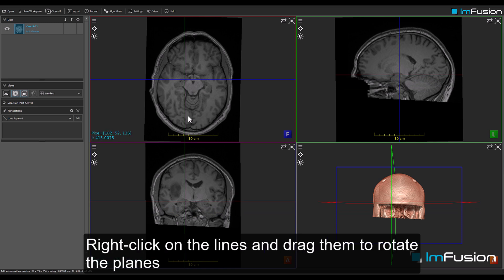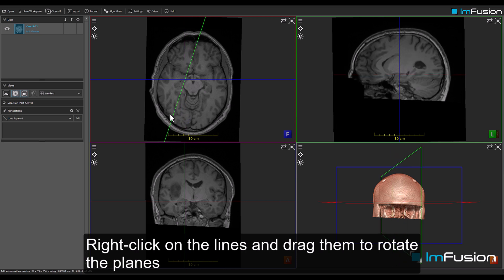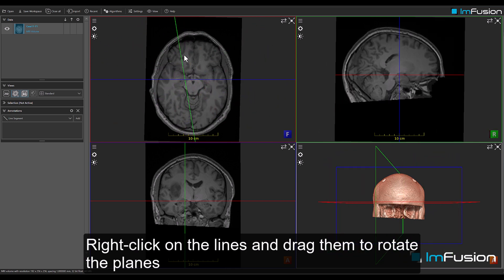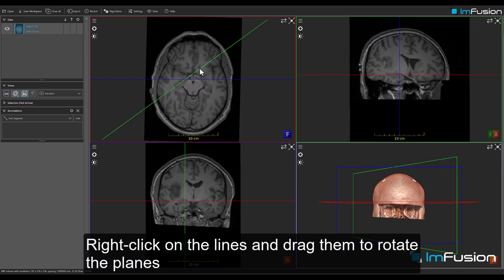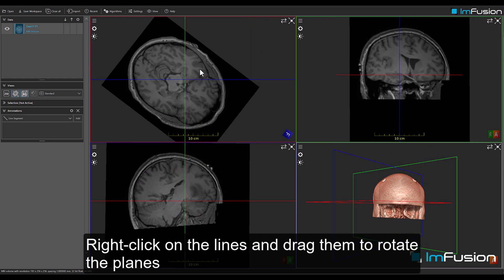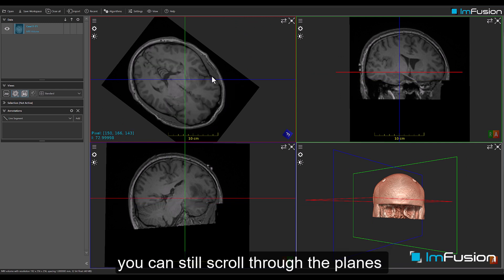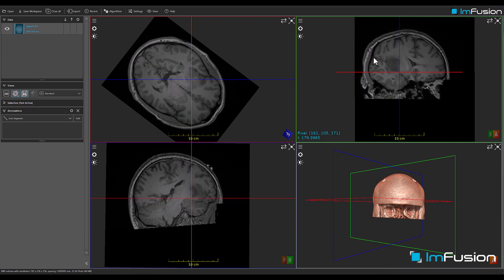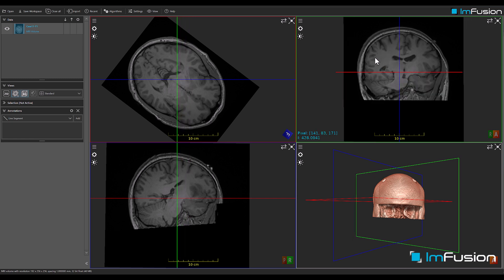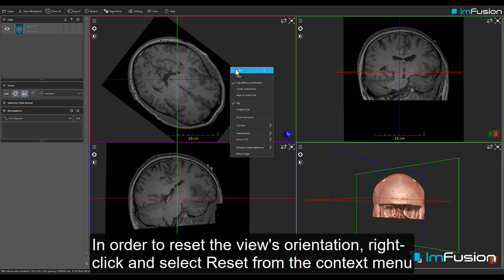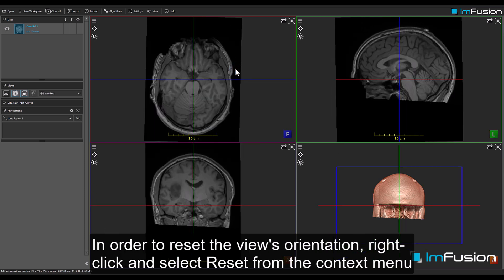Right-click on the lines and drag them to rotate the planes. In order to reset the view's orientation, right-click and select Reset from the context menu.